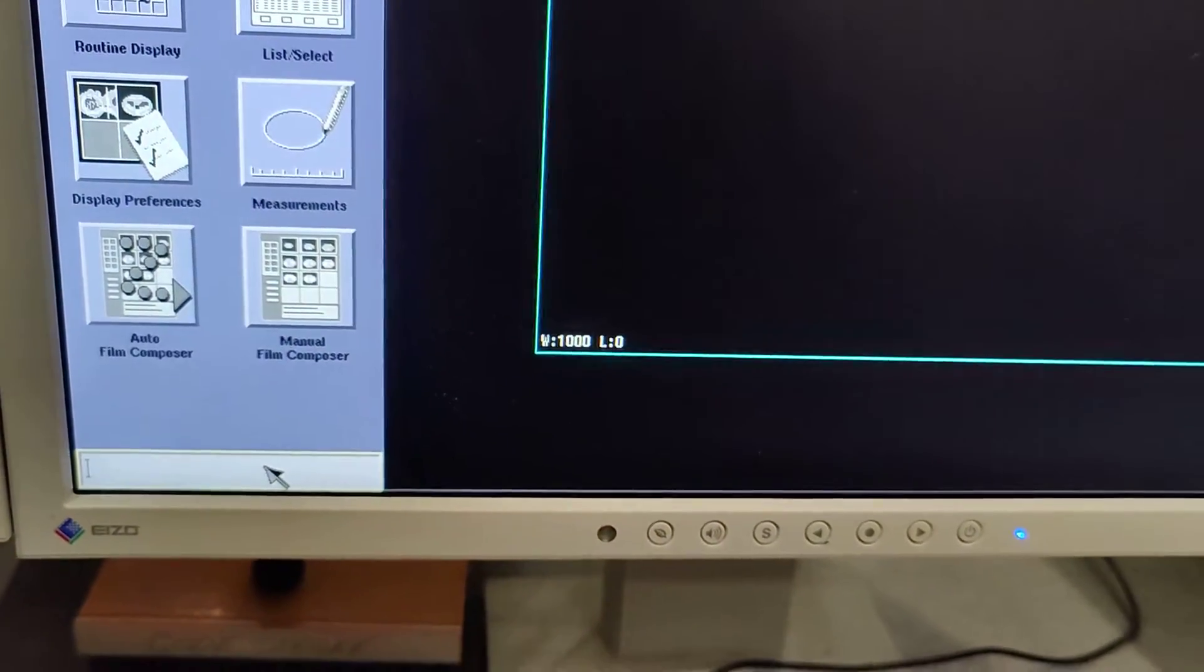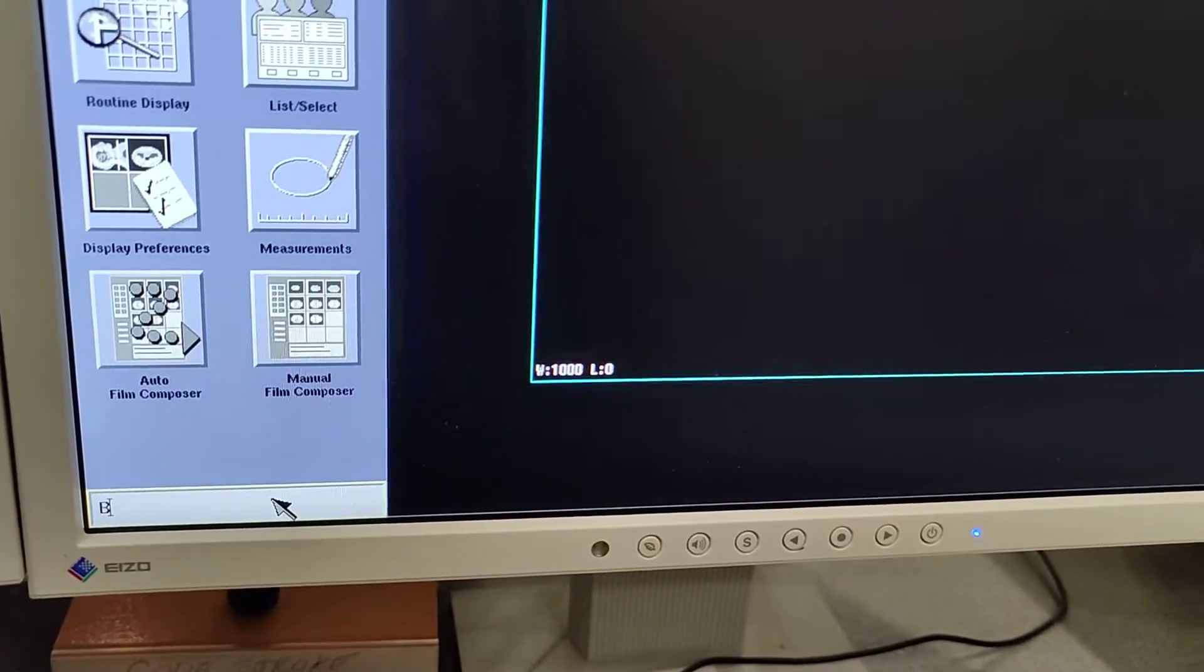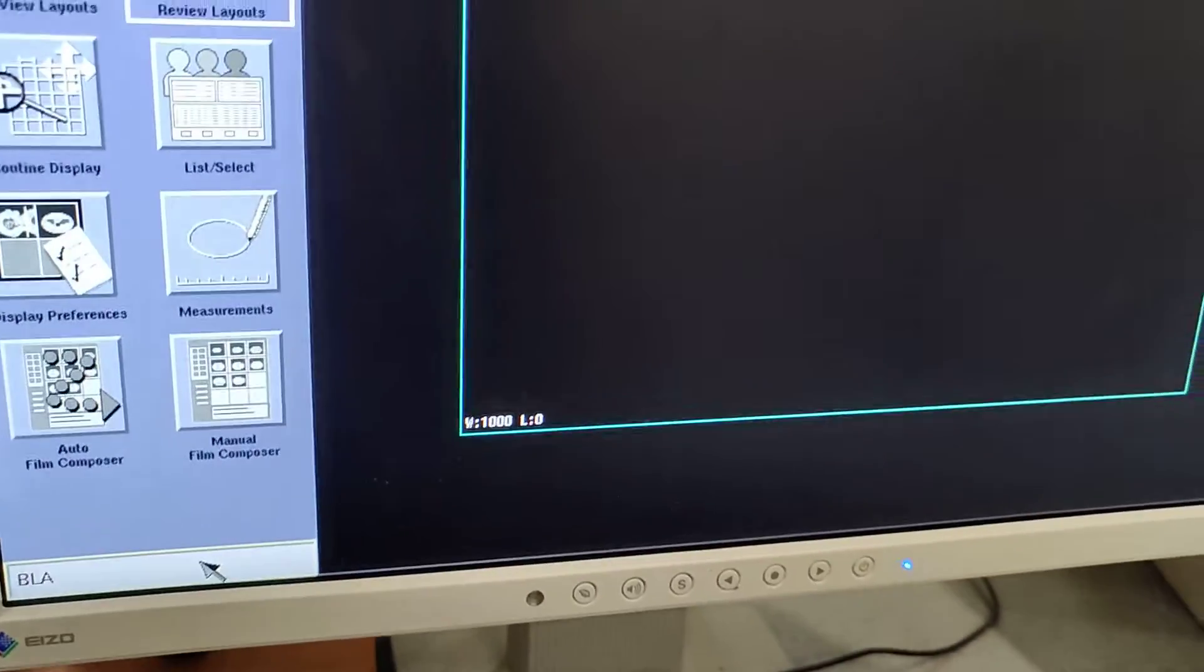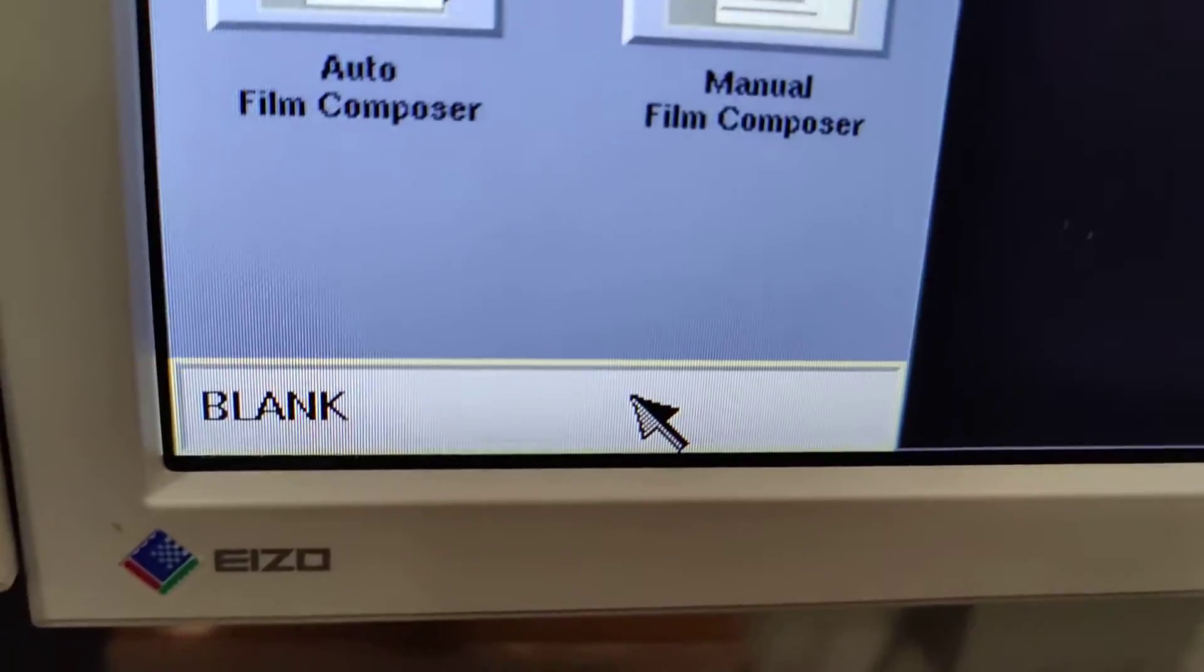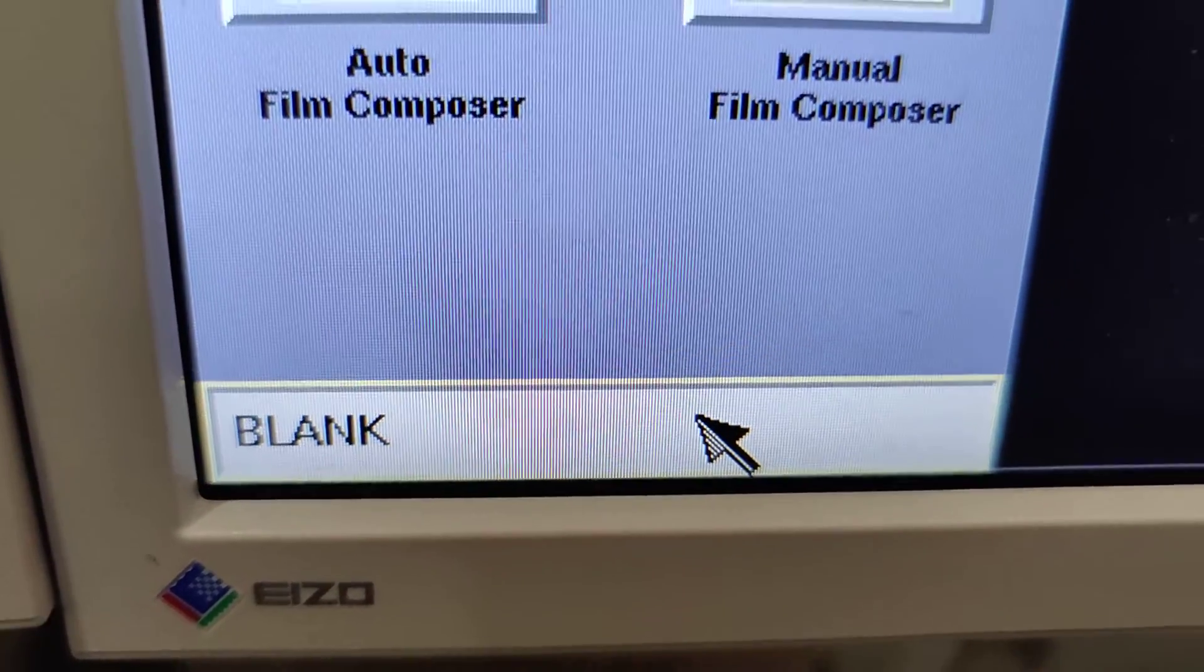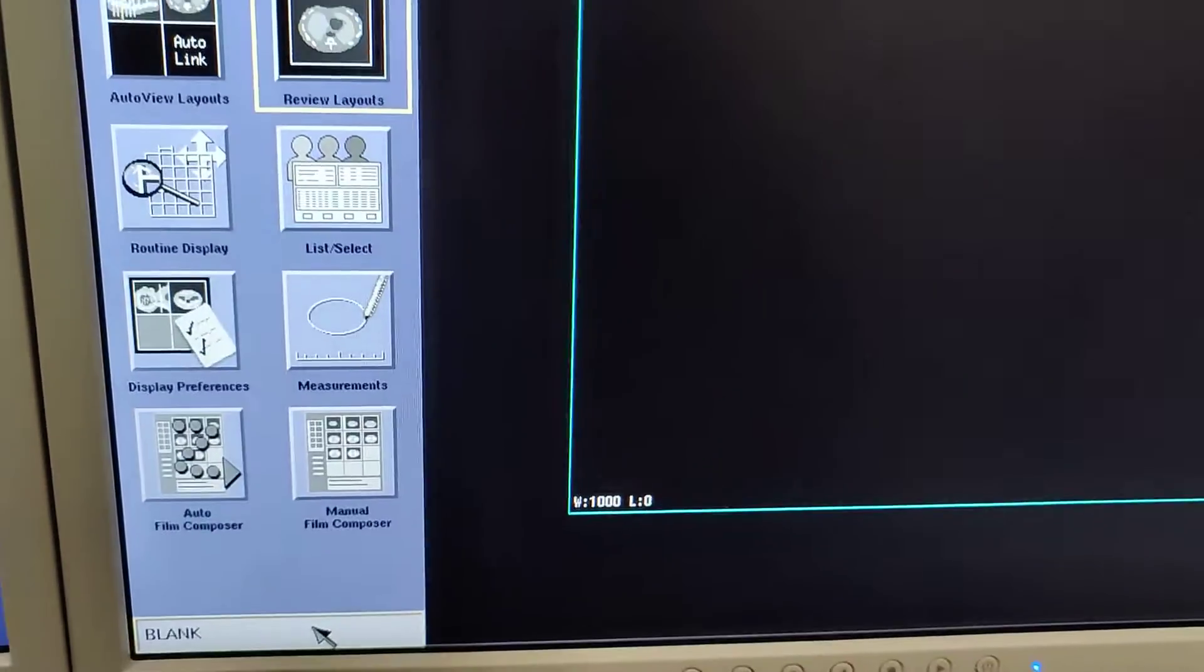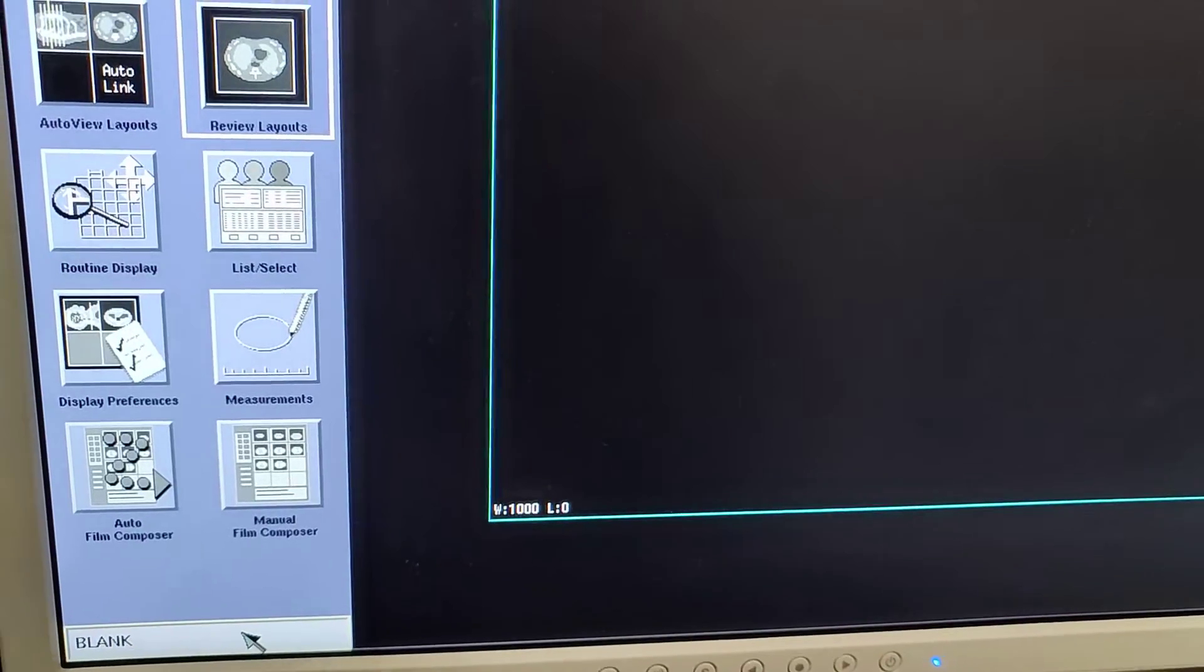And after that, go down here and type in BLANK. Then you'll press enter on the keyboard.